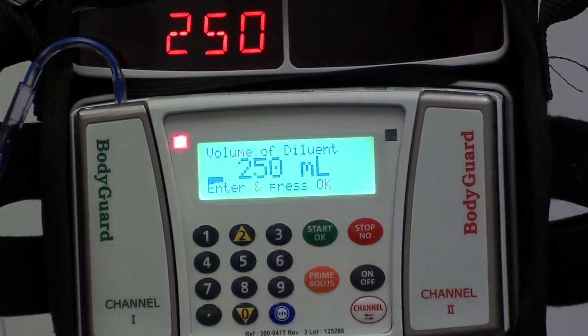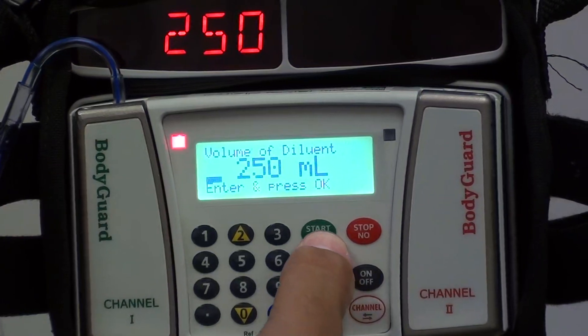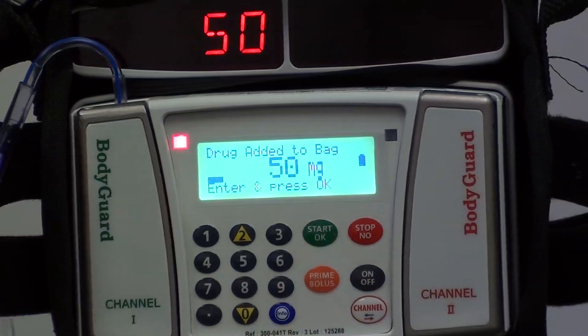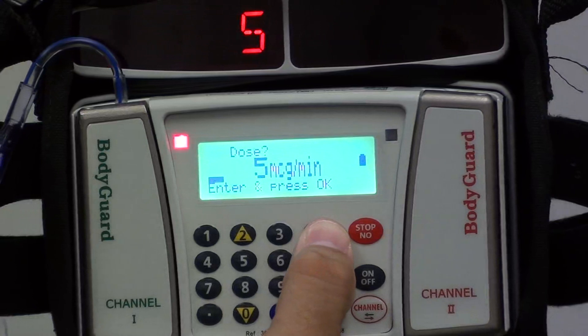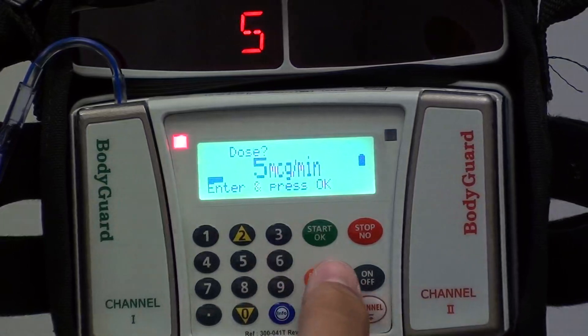It's going to ask you what the volume is in your bag or bottle — in this case we have 250 mLs in the nitro bottle. It's going to ask how much medication is in the bottle, then it's going to have you confirm the concentration. At this point you choose your dose; for this example we're going to set it at 5 micrograms per minute.